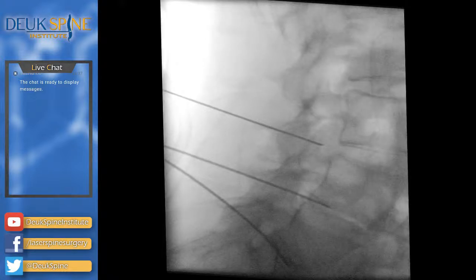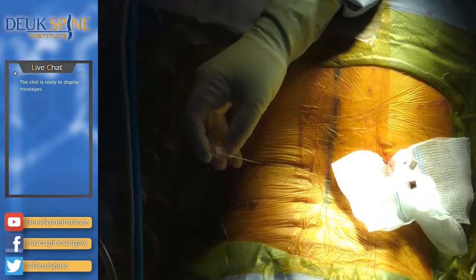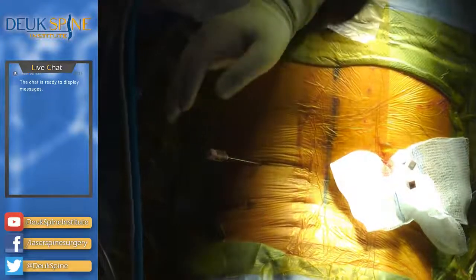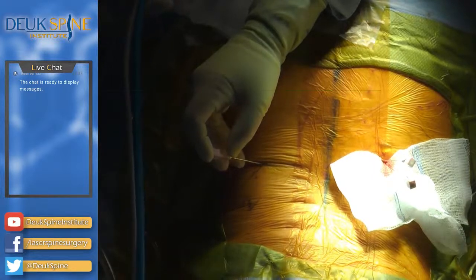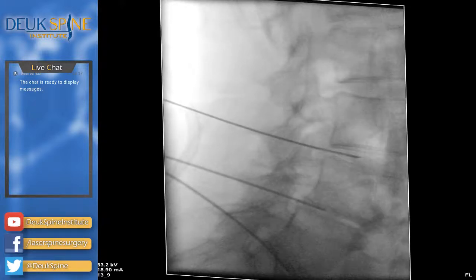You feel that in your back? That's your herniation at L3-4. It's huge. It's actually bigger than you see on the MRI because I'm encountering it right now, and look how far back behind the disc we are. That's amazing. You can actually see it. All right, you comfy? Relax. Don't try to pick your head up. Big tear. All right. Get ready to put her to sleep. We have one more disc to test.